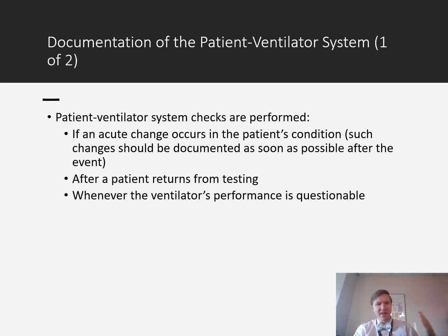Well, the patient had an acute change in desaturation. The subsequent result was on the PEEP FiO2 scale to go up to a PEEP of 12, right? So then we do a full assessment from there, right? Then we need to do it as soon as possible after that to show that intervention and then how the patient responded to our intervention.